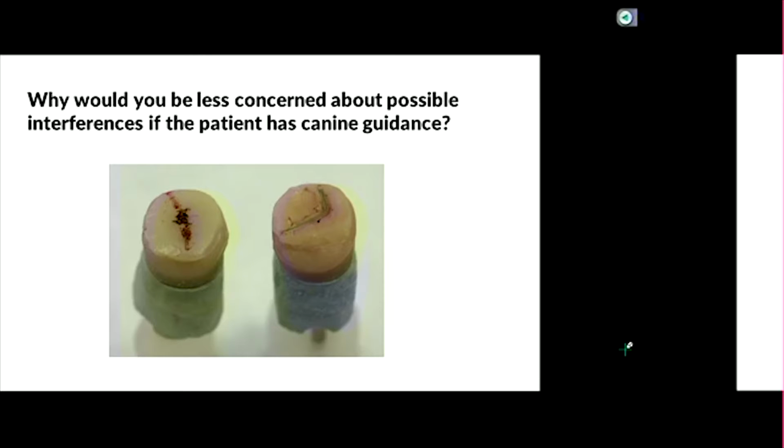Well, they're actually at 30. So we know at 30, they actually have more space in the back, right? Because we said, okay, as you steepen the inclination, you get more space. So in reality, you got more space there than where you had designed the crown to.